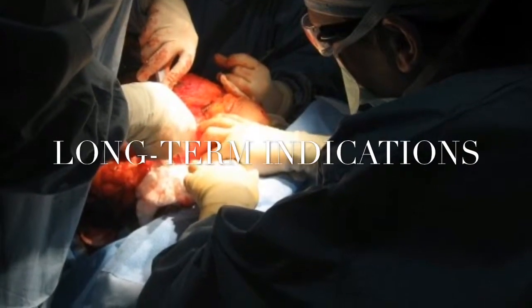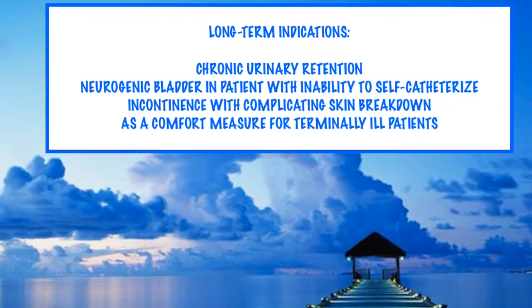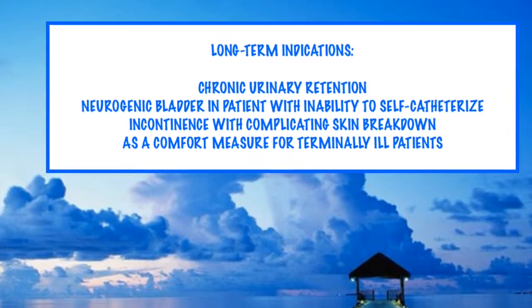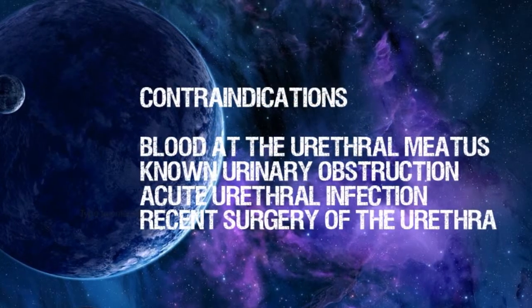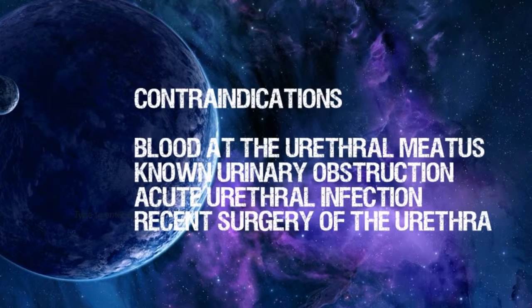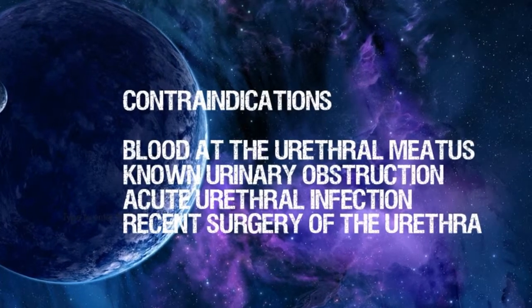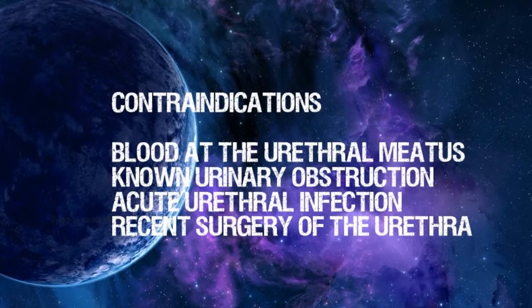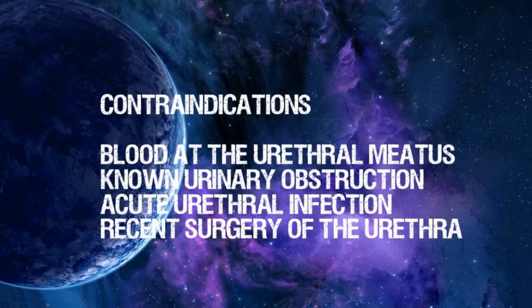Long-term catheterization is indicated in patients with chronic urinary retention, incontinence, and other incapacitating conditions such as Alzheimer's. While Foley catheterization is a relatively safe procedure, there are a few contraindications, including blood at the urethral meatus, known urinary obstruction, acute urethral infection, or recent surgery of the urethra.